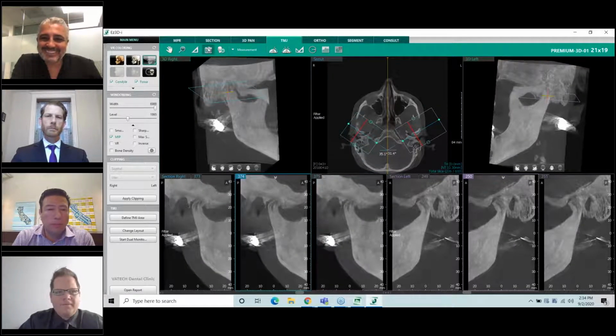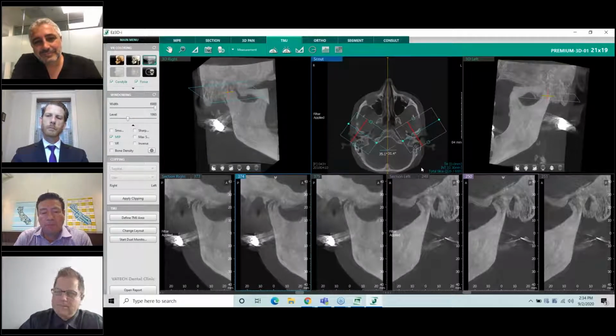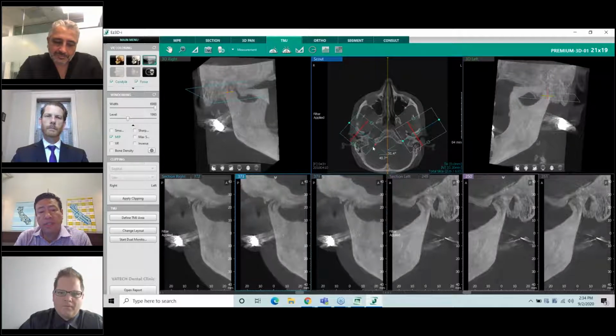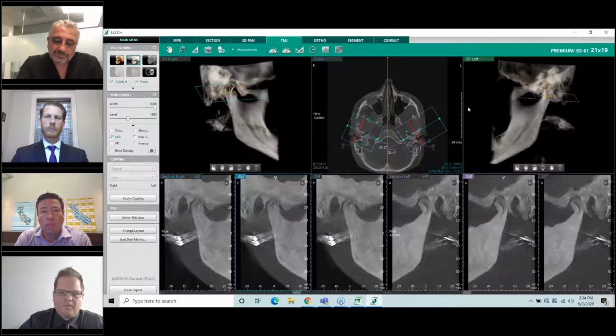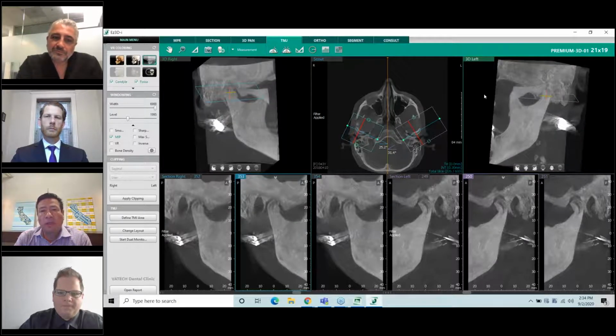And I think the important thing to highlight here is that aside from the clinical data that clinicians are obviously capturing with the cone beam, the power behind these images is how easy it is for you to get the data and present it to the patient, once again, to get them to better understand what's happening, why they're potentially clicking and popping, why they feel tired throughout the day. So these, again, are powerful tools.